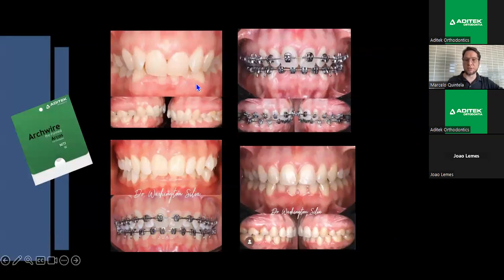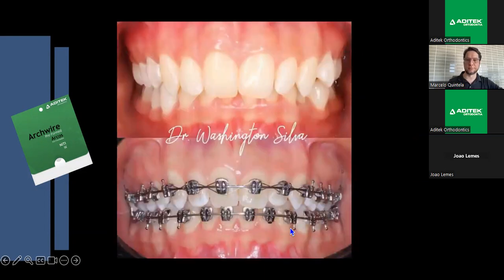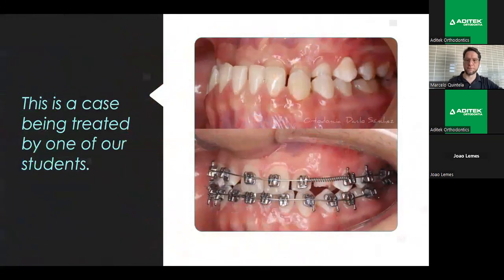It's another case of a student, a great deep bite, and reverse arch associated with a negative torque in the lower incisors. And finally, before and after, but don't forget, it is minus 11 associated with the reverse arch. Well, I just finished it.